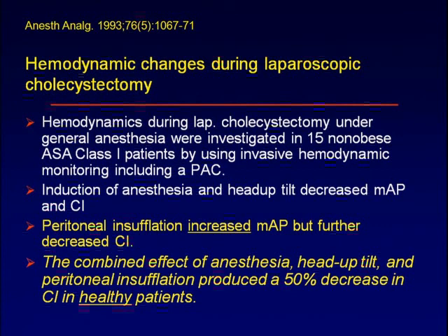Now, if we think about laparoscopy in particular, it's been known for a long time that even though we tell patients, well, it's just a laparoscopy, you'll be fine, it's actually not a benign intervention. This was published in 1993, a study that couldn't be done, I don't think, today, in which they took ASA Category 1 patients and they put invasive monitors in them, and they looked at hemodynamic responses to filling the abdomen with gas, creating this pneumoperitoneum.